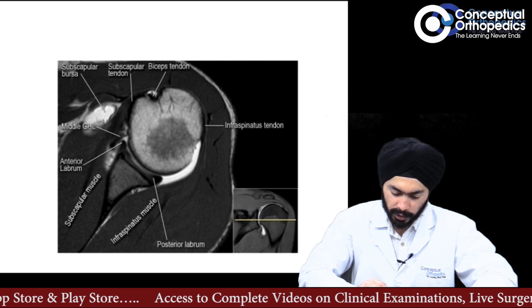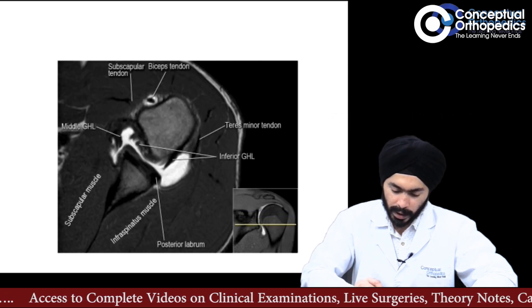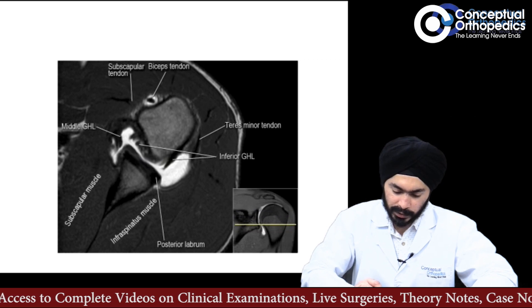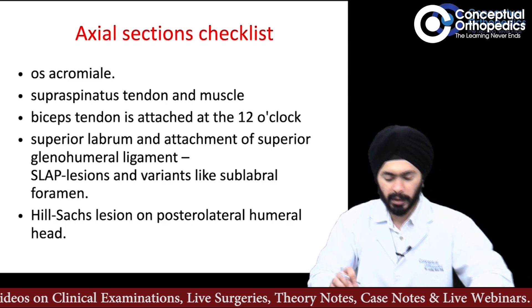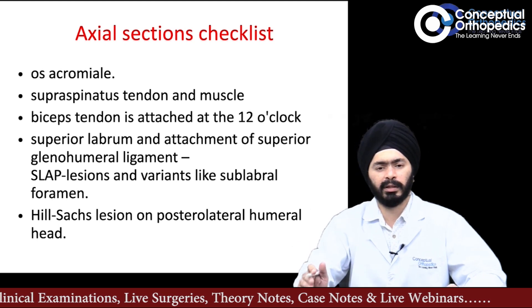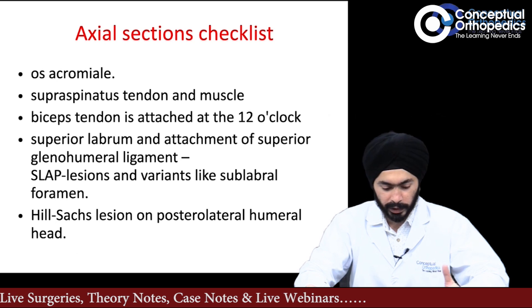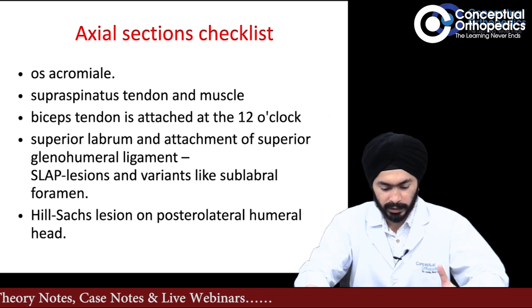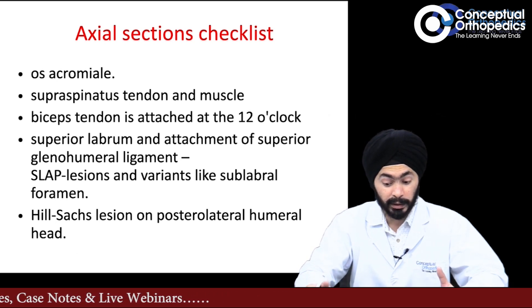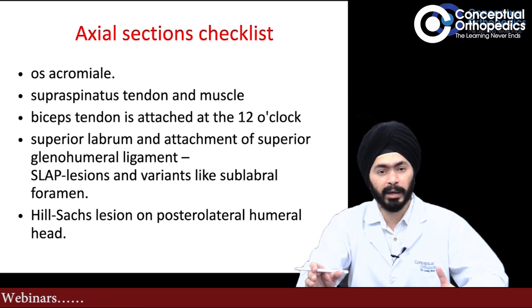Going further down, you can see good anterior and posterior labrum, and the biceps tendon — you may also see some edema around the biceps tendon. The axial section checklist includes: os acromiale, the rotator cuff, the supraspinatus and infraspinatus, the biceps tendon in the bicipital groove, and whether the biceps tendon is dislocated out of the groove.